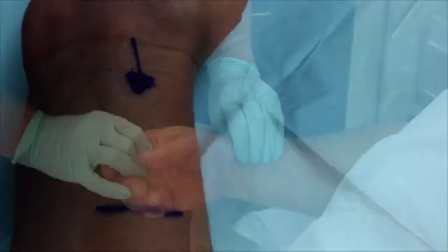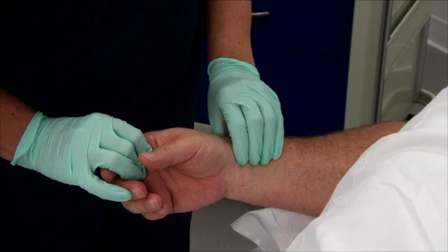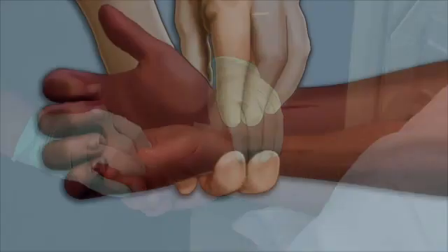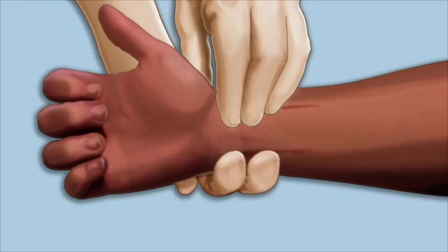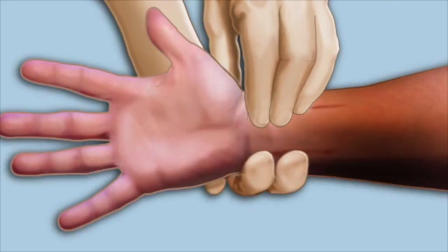Prior to a radial arterial catheter insertion, an Allen's test is performed to confirm adequate collateral circulation. An Allen's test is performed by compressing both the ulnar and radial arteries. Begin by having the patient clench their fist for 30 seconds. Next, have the patient unclench their fist while still compressing the ulnar and radial artery.